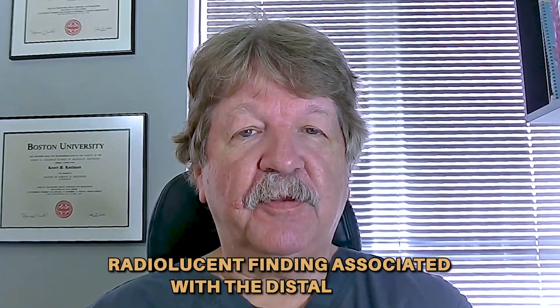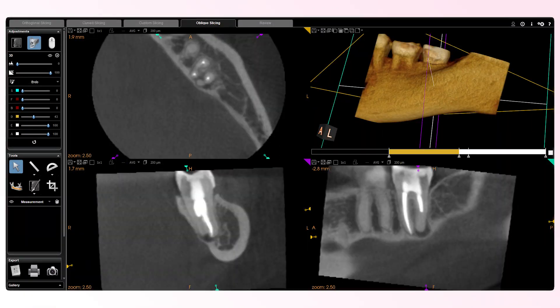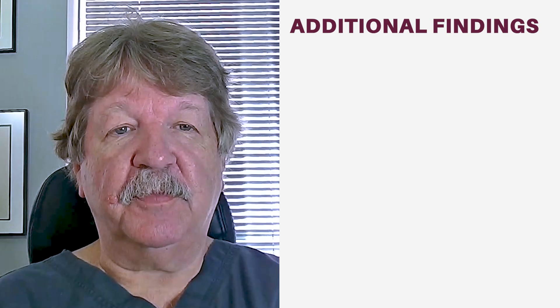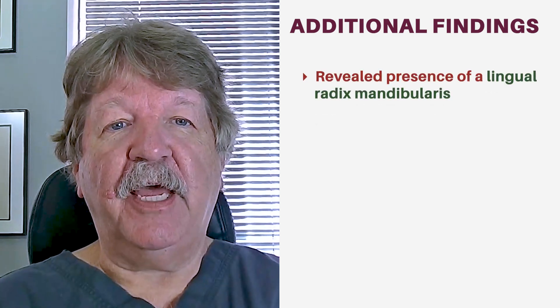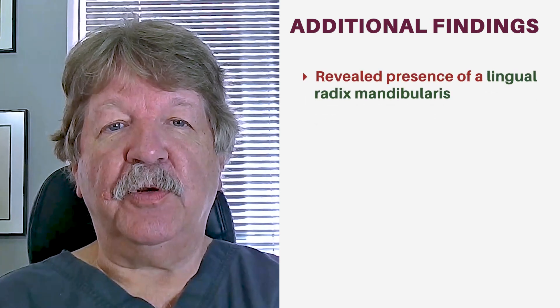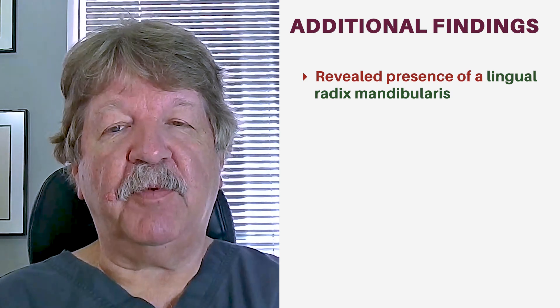Conventional periapical imaging showed a radiolucent finding associated with the distal root. CBCT imaging confirmed the finding associated with the distal root. However, further examination of the root in the CBCT image revealed the presence of a lingual root — a fused radix mandibularis.